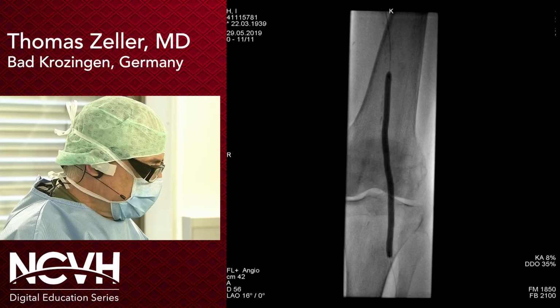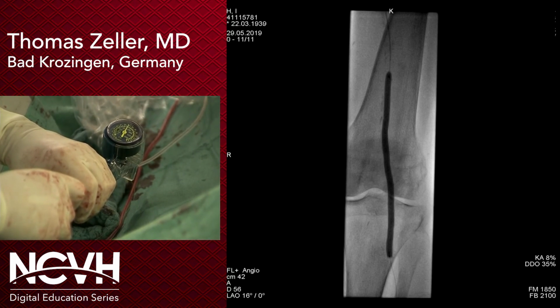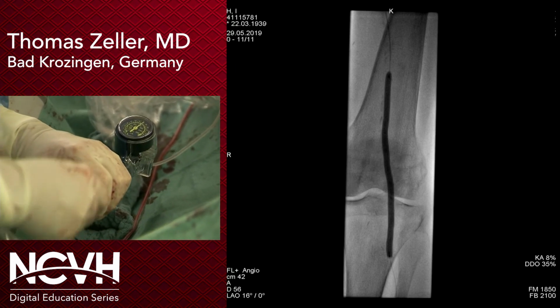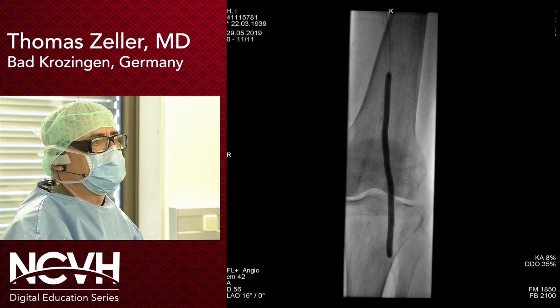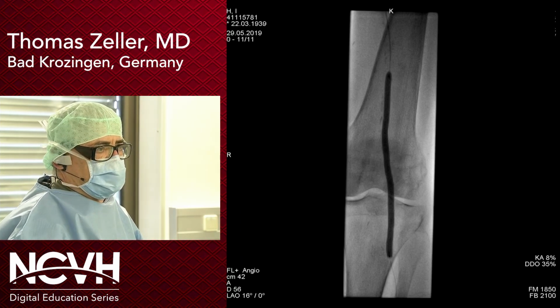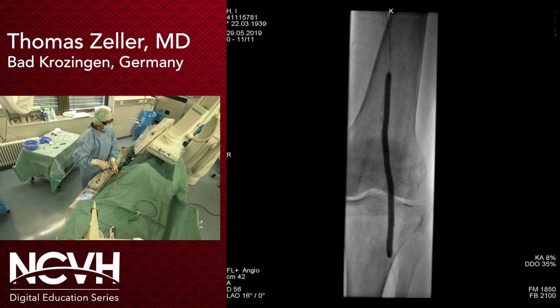Yeah, it's just part of the lessons that we learned from the LEVANT 2 study, right? And you're using like a 1.1 to 1 ratio, balloon to artery, in order to improve. Exactly. I'm intending to use a balloon which is slightly bigger than the reference vessel diameter. This guarantees you full wall apposition in all parts of the lesion, and with this, the best possible drug release into the vessel wall. So I did start the timer with a little bit of delay, so we are about 3 minutes now with balloon inflation.